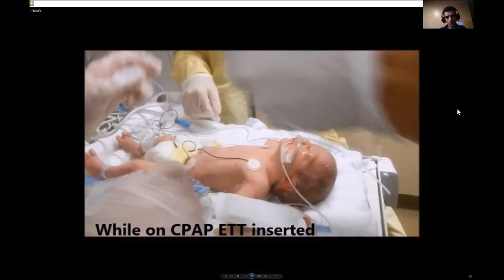We use a catheter called MAC, or multi-axis catheter, that is enclosed within a sterile plastic sheet and never opened to the outside. The reason for that is to minimize the contamination of surfactant.